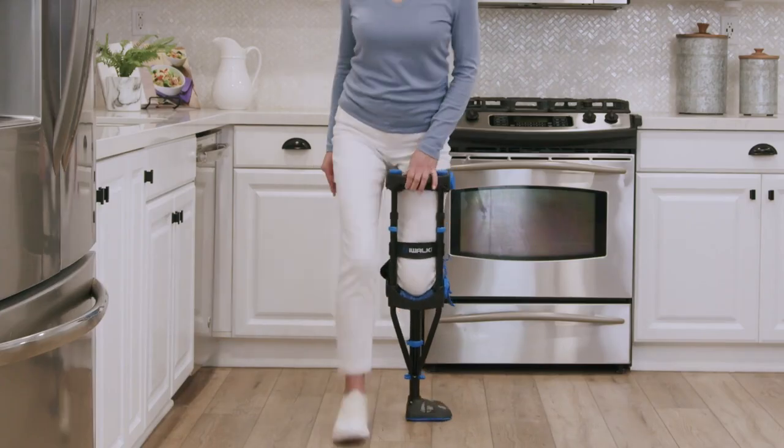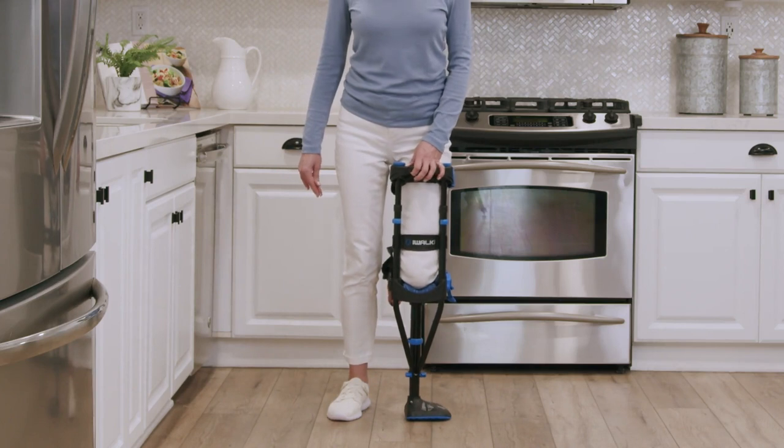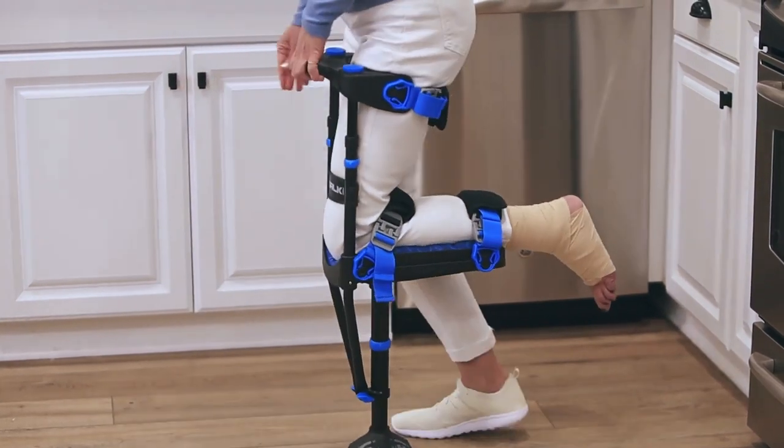Try again — step forward, then back. Repeat this exercise until you can do it fluidly. Continue the exercise, but this time step back slightly further, behind your iWALK foot. Keep going until your motion is consistent and fluid.